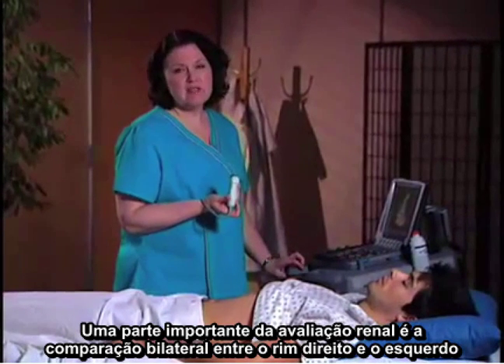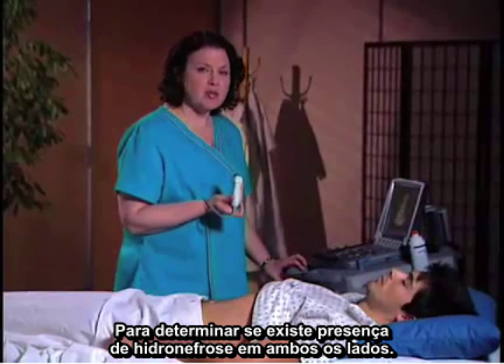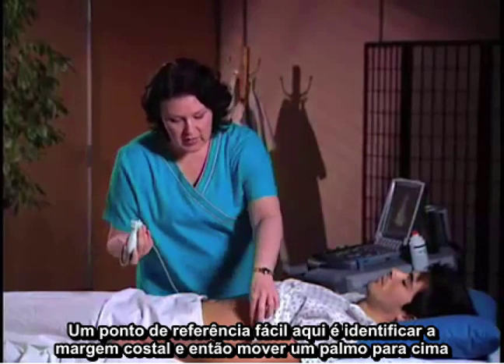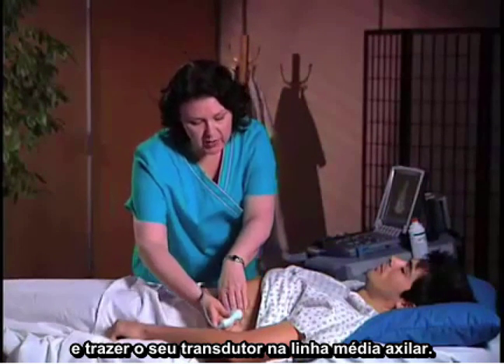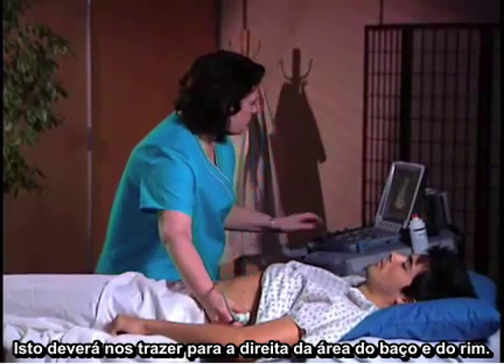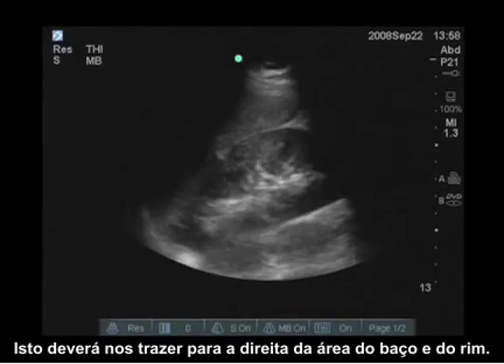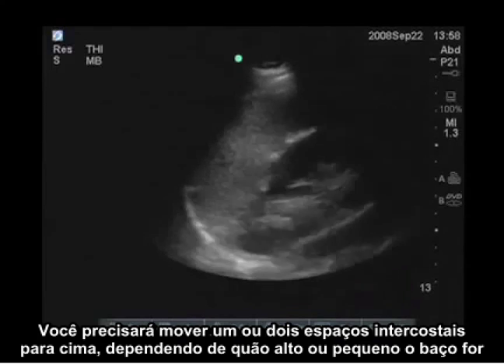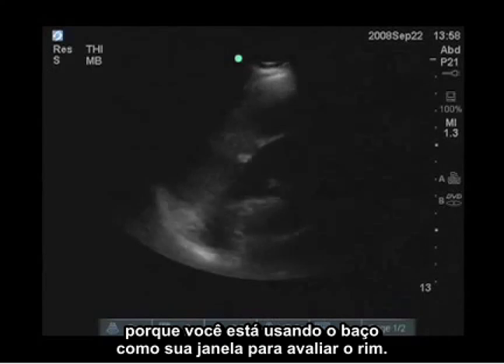An important part of a kidney evaluation is a bilateral comparison between the right and left kidney to determine if there's hydronephrosis present on one side versus the other. So we'll go ahead and do the left side as well. An easy landmark here is to identify the costal margin, move up one hand's width, and bring your transducer in at the mid-axillary line. This should get us right in the area of the spleen and the kidney. You may need to move up a rib space or two, depending on how high and how small the spleen is, because you're using the spleen as your window to evaluate the kidney.